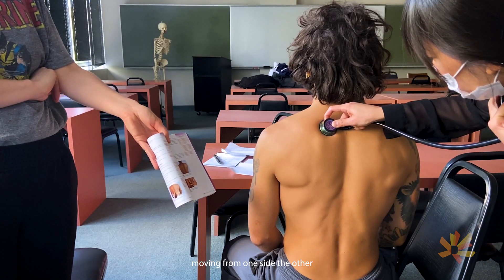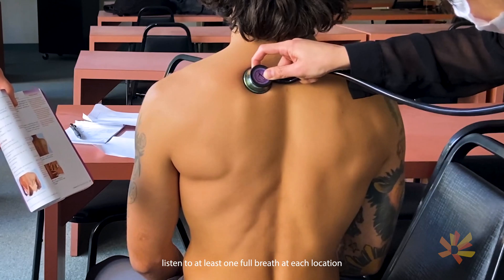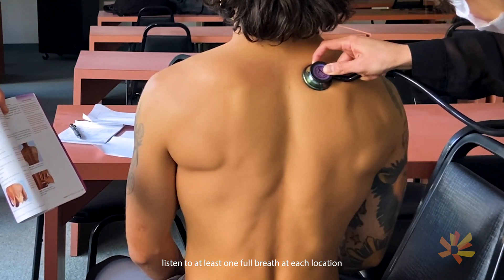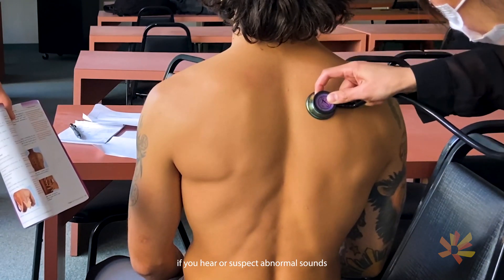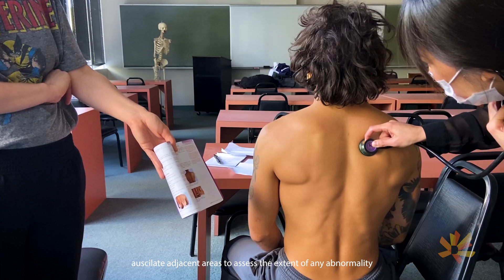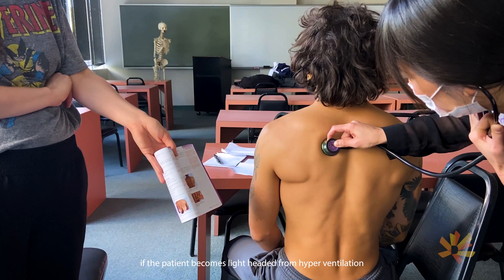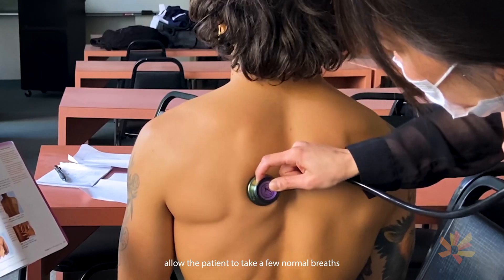Moving from one side to the other, comparing symmetric areas of the lungs, listen to at least one full breath in each location. If you hear suspect abnormal sounds, auscultate adjacent areas to assess the extent of any abnormality. If the patient becomes lightheaded from hyperventilation, allow the patient to take a few normal breaths.